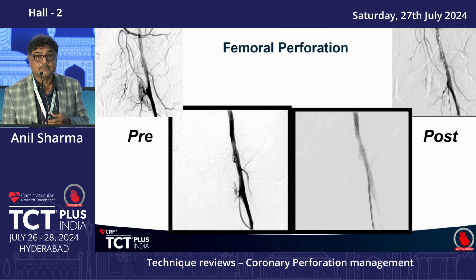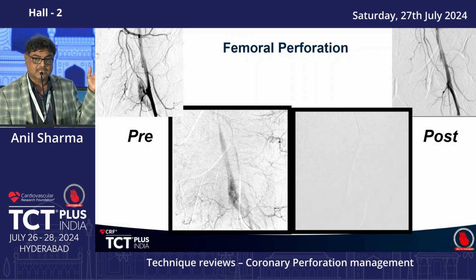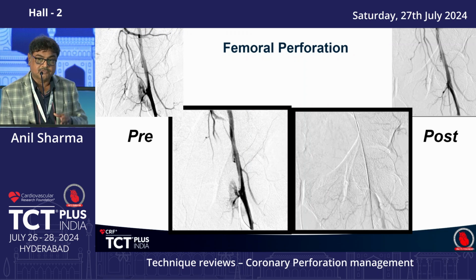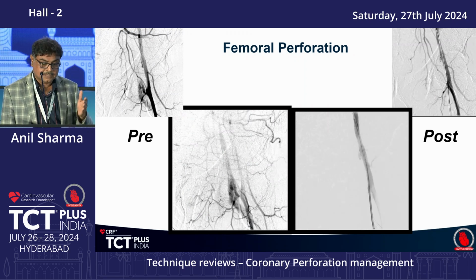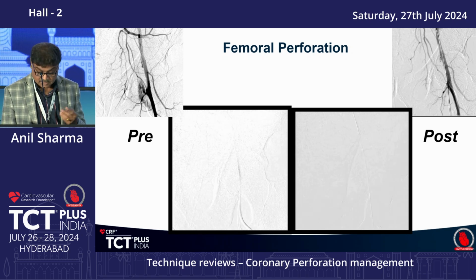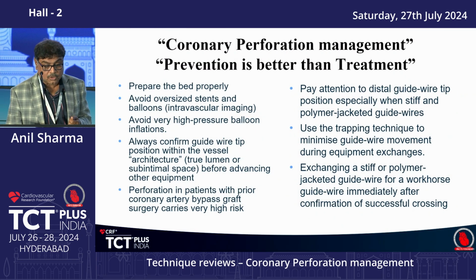And this is another case about the perforation. This patient had problems, another patient had a left main aortic dissection, perforation, again hypotension. We kept on looking in the heart. Then after some time we realized, we took the shot, and it is the femoral perforation which we could finish very well. So prevention is better than cure.